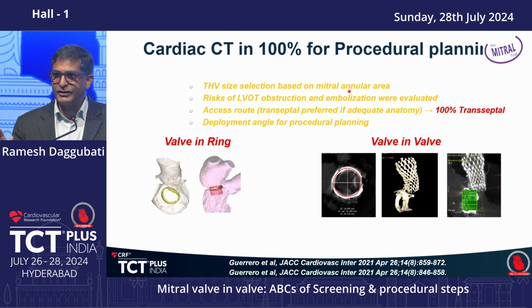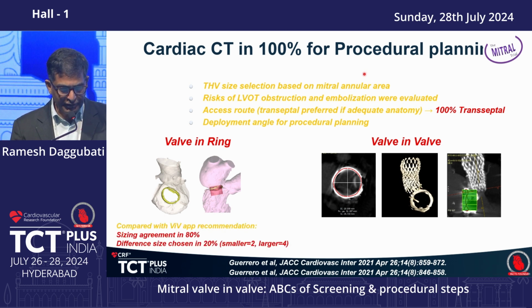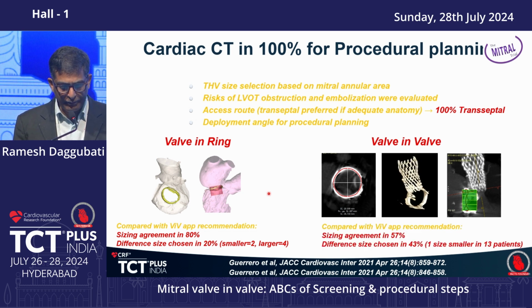Cardiac CT is mandated. Recently, one of my colleagues posted a valve-in-valve without a cardiac CT, so we nixed it in our multidisciplinary conference. We said, no, you need to get a cardiac CT first, and the cardiac CT is very important because it shows how these patients are going to tolerate the mitral valve-in-valve procedure, because of the neo-LVOT. With the new virtual valve, you can see how much the LVOT is reduced, which will impact their outcomes as well. We'll go over that in a couple of minutes.